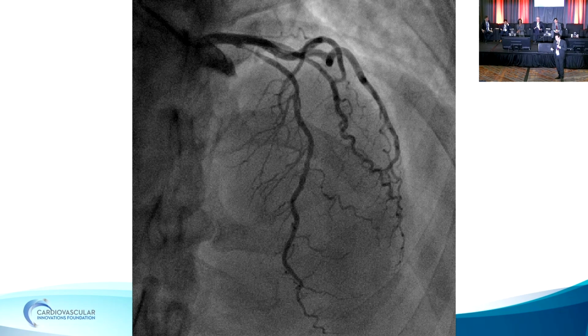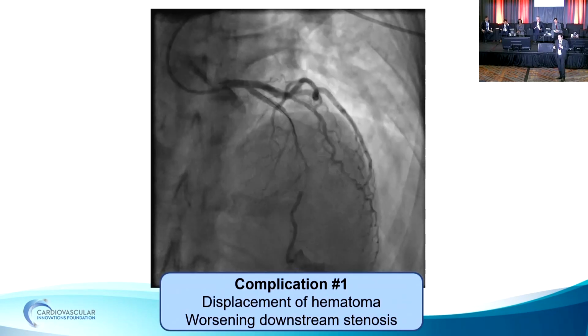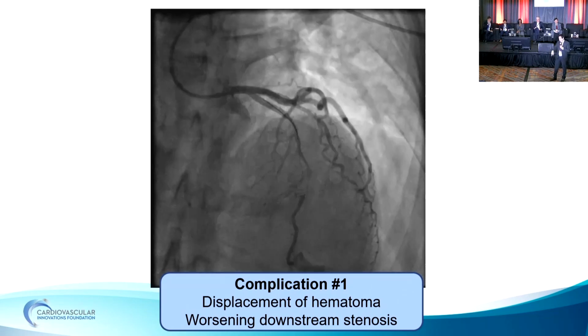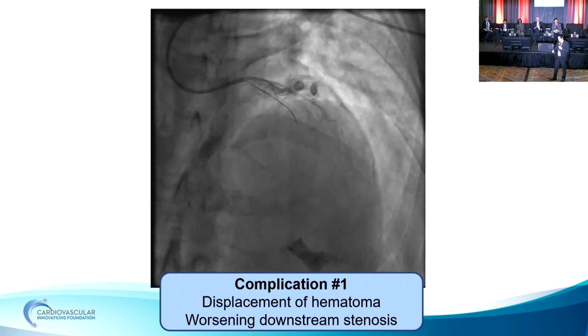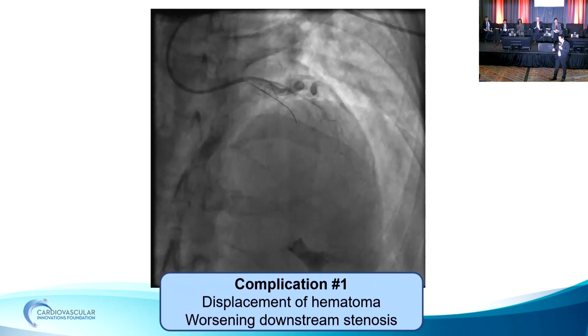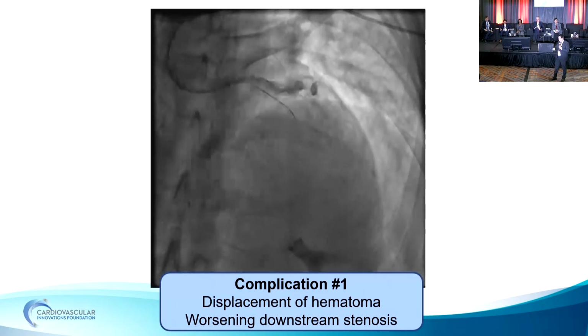But I wanted to show this because stents we're all very used to in the plaque world, but stents and intramural hematoma behave differently. Sometimes fantastic, but sometimes they cause complications. 3 complications in this one case. First, you see the stent was placed, and you see how the intramural hematoma is toothpasted downstream. You'll see that. So now flow is reduced, and there is this high-grade stenosis all downstream. The stent itself looks spectacular.